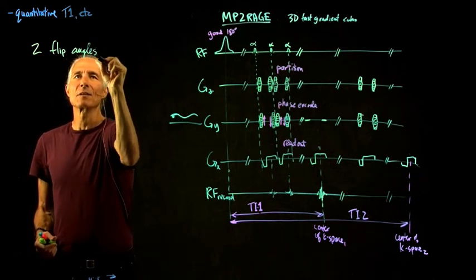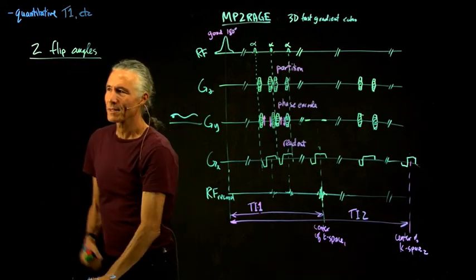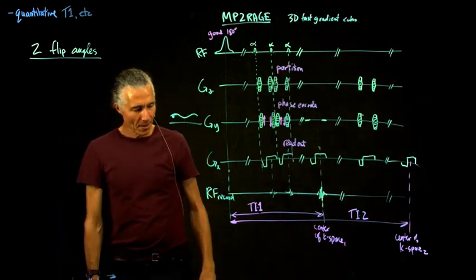I didn't do the conceptual part of this. I just used it. But you could also collect two flip angles. And so what's the idea here?